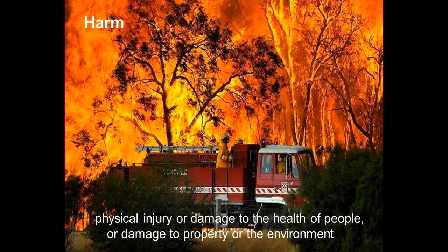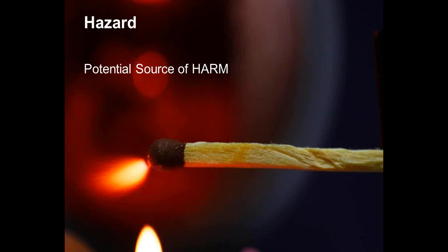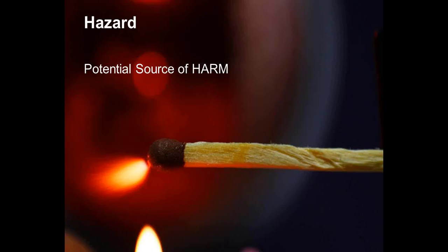Physical injury or damage to the health of people, or damage to property or the environment, is a harm. So in the medical device industry, if you're looking at software, clinical safety is very important, and clinical harm is what we need to arrest. You cannot have a clinical hazard, a hazardous situation, and a harm happen to the user. If there is a hazardous situation, we will have to go back and see what the risk is. Risk is a combination of probability of occurrence and the severity of that harm.